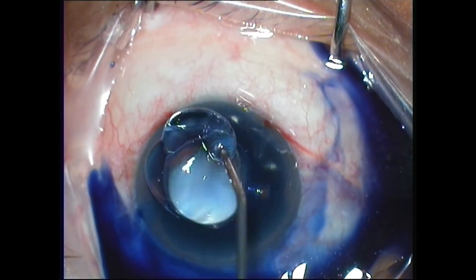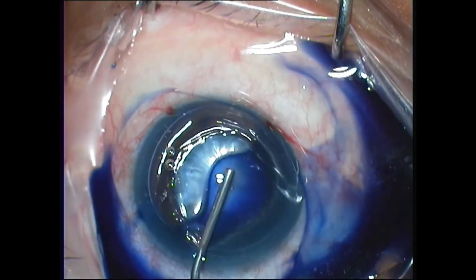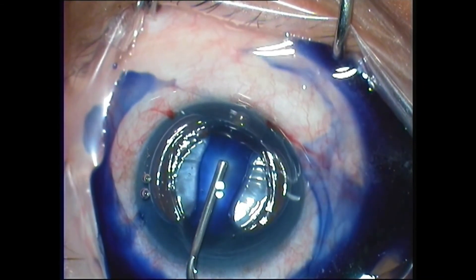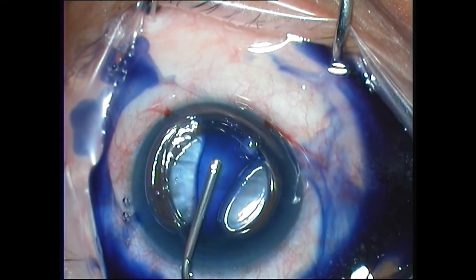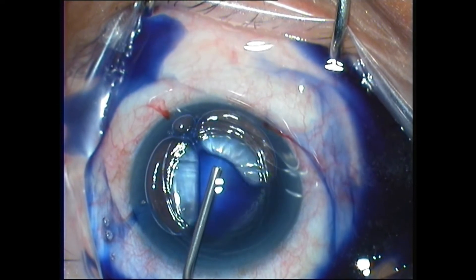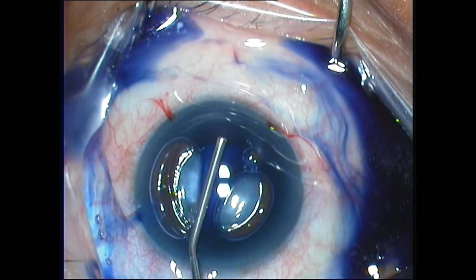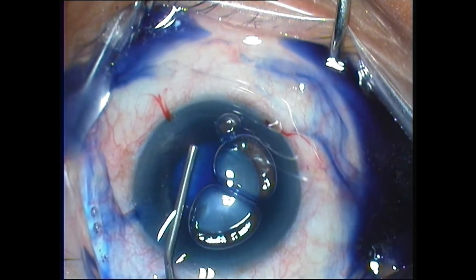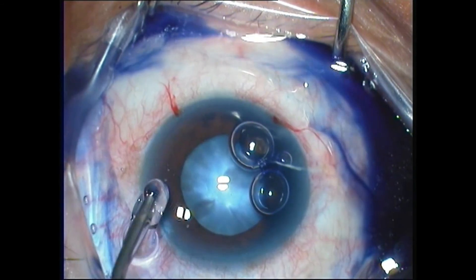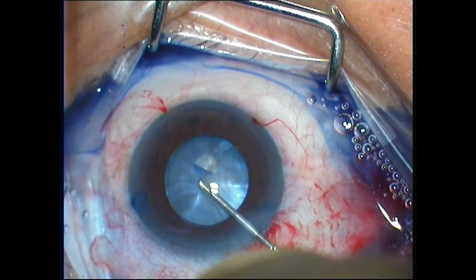In order to spread the Trypan Blue evenly over the anterior capsule, put a blob of viscoelastic on the cornea and gently press with the cannula. This causes the air bubble to break up and disperse, and by moving it from side to side, it's possible to get a good even stain of the anterior capsule without having a stain-free patch. That's how you get it right when you use Trypan Blue.